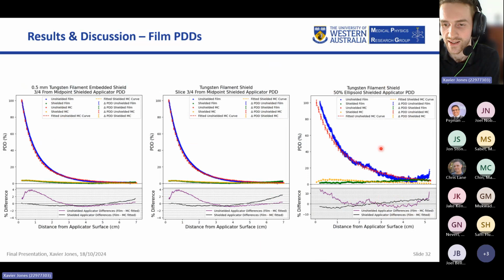This results in PDDs needing to be derived from regions with more noise prevalent, and it is likely the dose prescription was increased to increase the signal. Similar results to those produced by the spherical applicators will be found. Overall, however, the relatively high correlation between the Monte Carlo and film data further provides validation of the simulations.